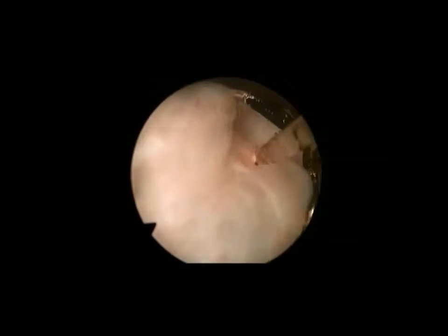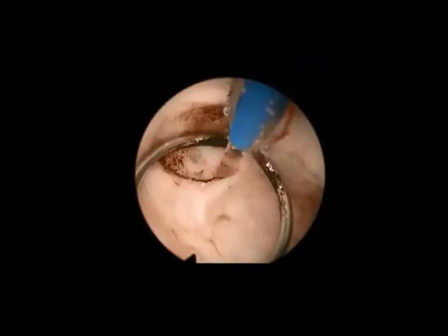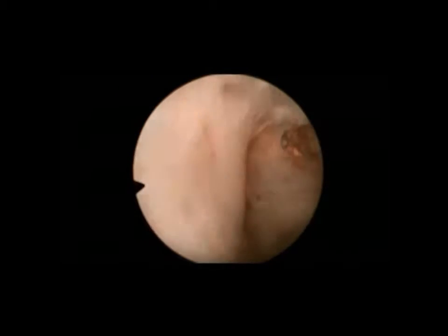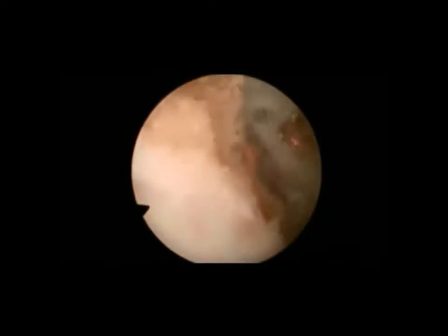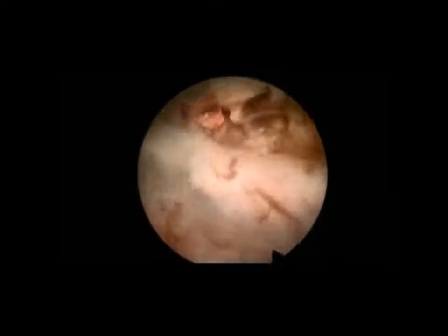Here we are working counterclockwise, rolling up to establish that anterior space, utilizing a combination of blunt and sharp dissection. We have been at 40 watts, but we can go up to 65 watts at this point. We're mindful that we have freed all of the distal prostate apex. We want to go beyond the midline, go beyond 12 o'clock before working more proximally toward the bladder neck.